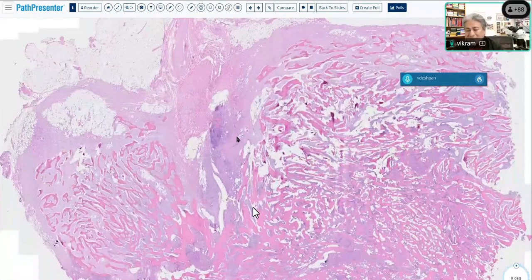One of the things that really helps on a biopsy is an immunohistochemical stain for MDM2. MDM2 is amplified, and we use immunohistochemistry as a surrogate marker for the amplification. The gold standard is always FISH, but immunohistochemistry works just as well in most instances. Parosteal osteosarcoma and well-differentiated osteosarcomas are two types of osteosarcomas where you do see MDM2 amplification.